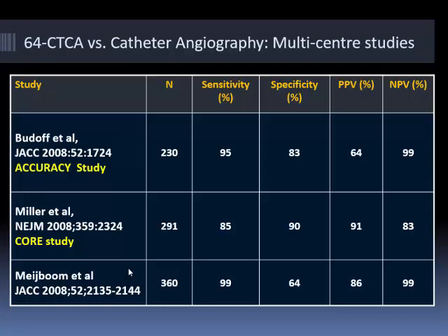So for the negative predictive value, what do you mean by significant coronary artery disease? Well, what I'm saying is potentially flow limiting by significant. So obviously you will identify a group of patients, and we'll come to that when we talk about prognosis. You'll get additional information as to their atherosclerotic burden, which obviously is important. But in terms of identifying a group with potentially flow-limiting disease, which if you look at some of the studies, some of them define as greater than 50%, because 50 to 70%, as you'll come to understand, is a grey zone with any anatomical imaging, be it angiography, be it CT angiography.